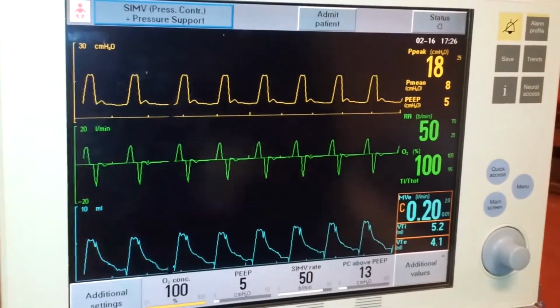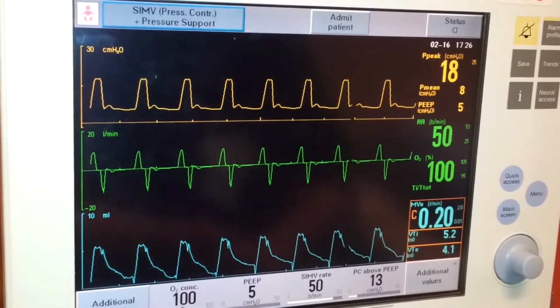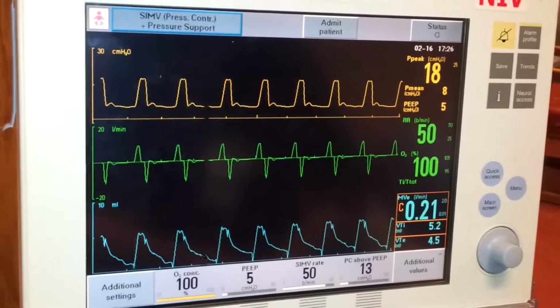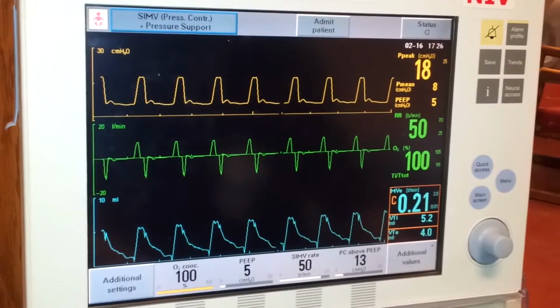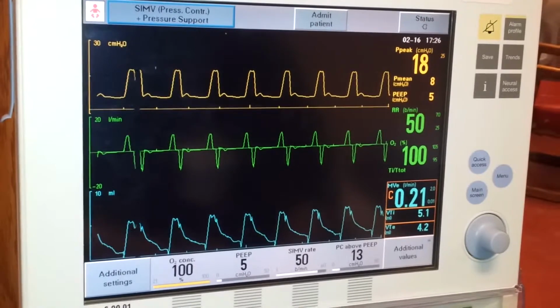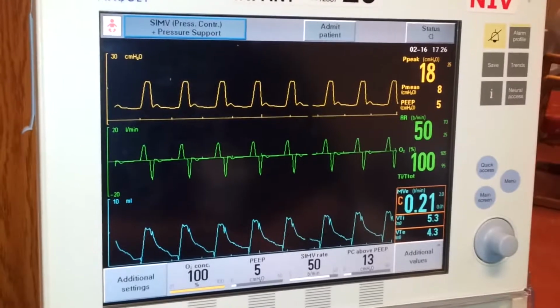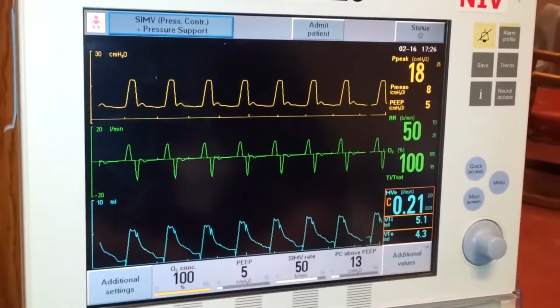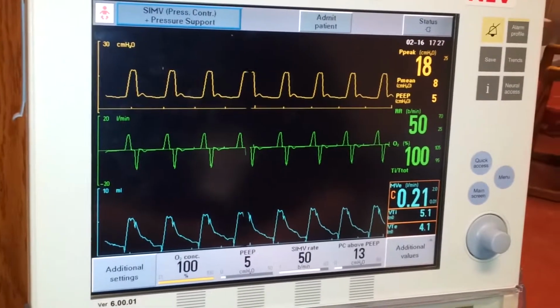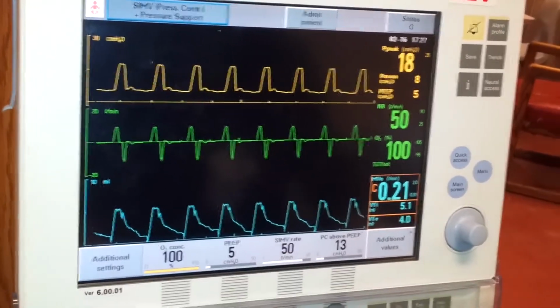So step 6 is basically your vent check and documentation. You want to do your initial vent check, including your parameters, alarms, auscultation, and plan for this patient. That part's pretty easy. So step 7, the instructors are going to give you an ABG, which you will have to interpret and make any additional changes that may be required on the ventilator. You should also ask for blood gas to be done. And if you don't, they'll just tell you the blood gas has come back. But yeah, that's pretty much it for this CBO.